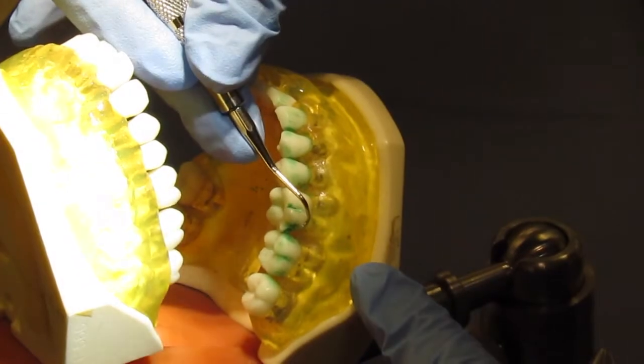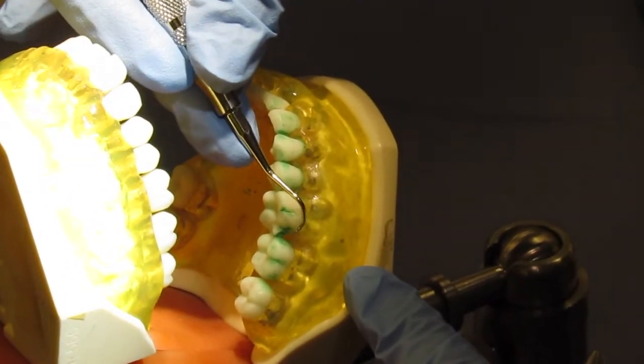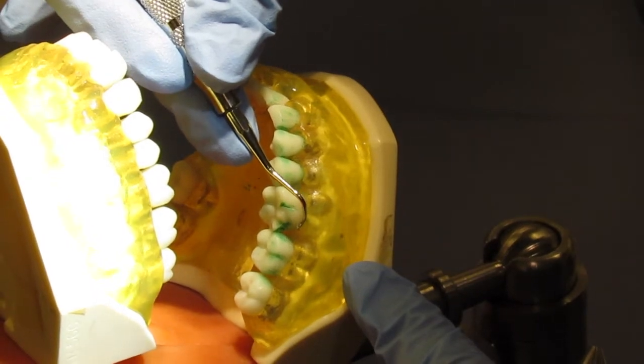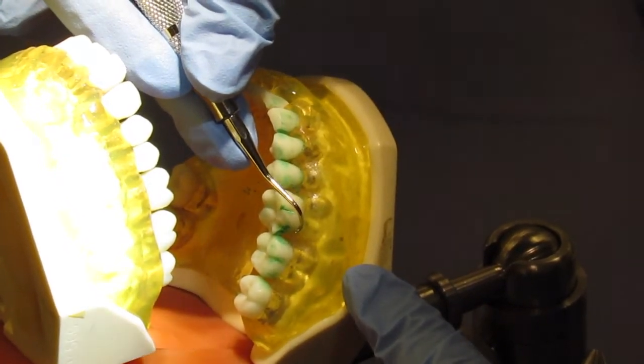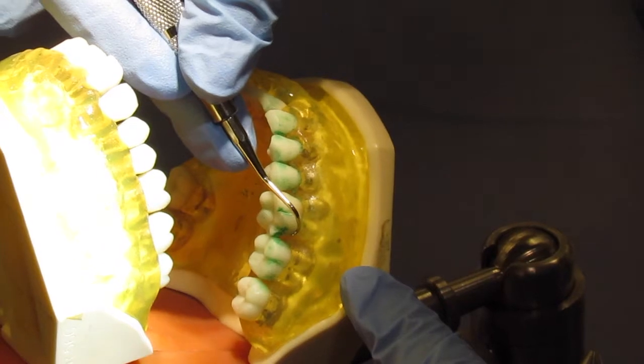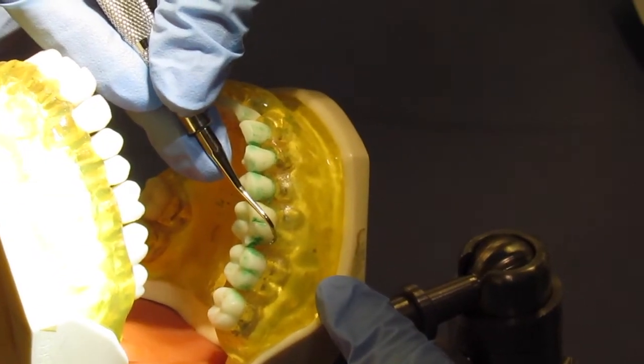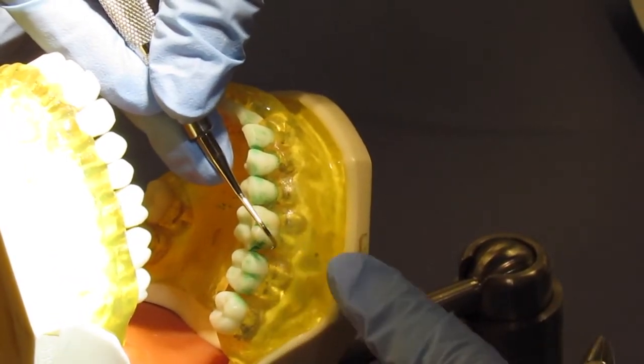Do the universal curette. We're going to start on the distal surface, so first point your toe back toward the distal and then apply the secondary blade to the distal line angle and make sure the terminal shank is in a fairly upright position.